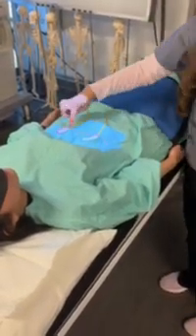Okay, so now the next one will be the 5 minutes. You come in, take another one. But then you start seeing a lot more of the kidneys. Then you do an 8 minute again. Same positioning, right at that.